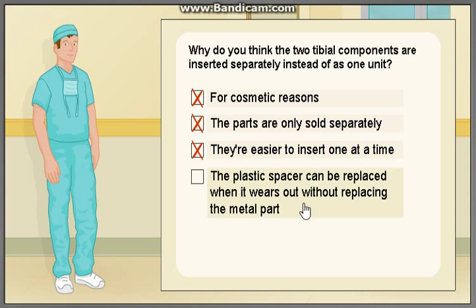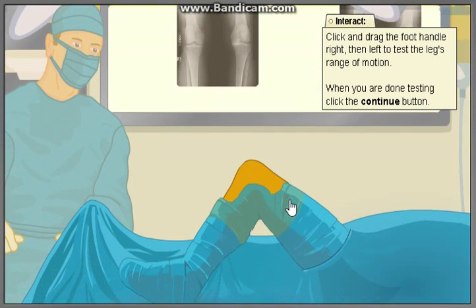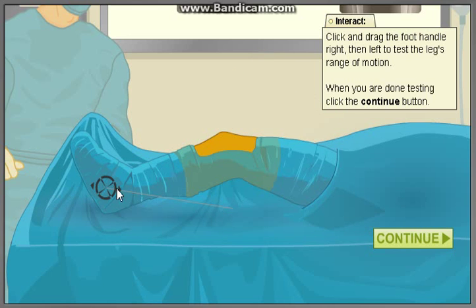Fantastic. Conduct range of motion tests to assure proper knee alignment and successful prosthetic fit. Typically, a normal range of motion allows the leg to move from 0 to 130 degrees. How does our patient's range of motion look?